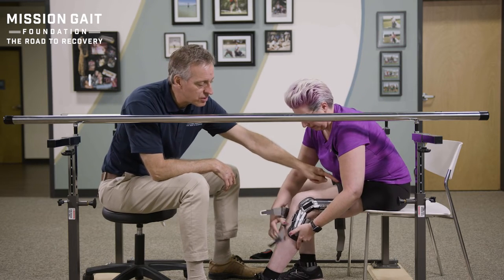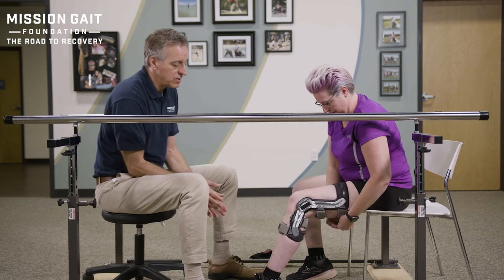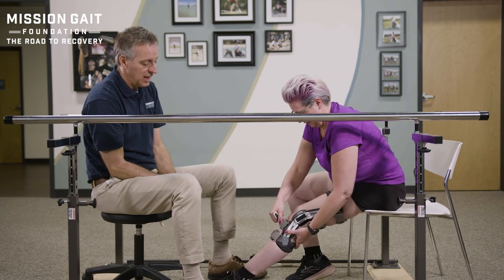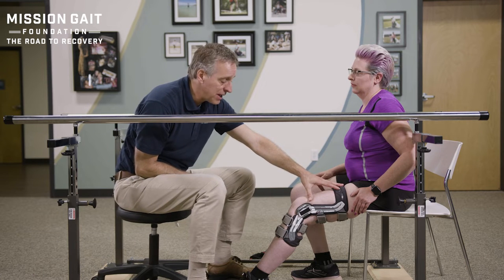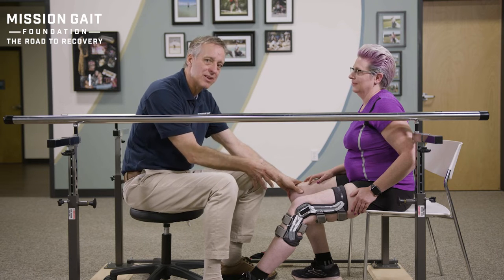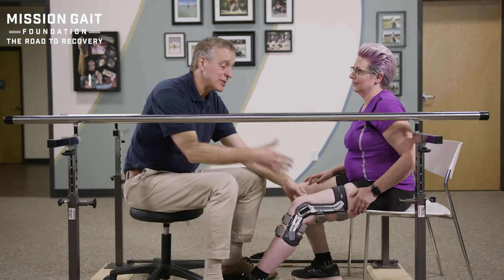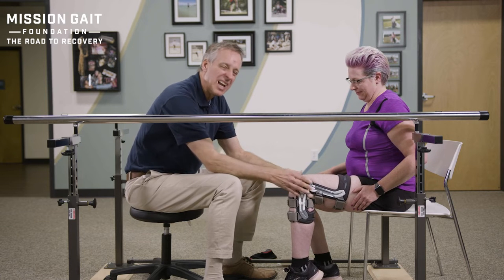Take your time with this. I've seen patients come in with braces on the wrong leg — remember, these are leg braces for one leg only, especially if custom fit. I've seen them upside down, so make sure you talk to the patient about top and bottom. And the last thing: I've actually seen them on backwards, so the knee wouldn't bend at all — unless you have a flamingo, the knee was not going to work. You really have to talk the patient through that process and have them bend it back and forth a few times to make sure they feel the compression and are comfortable.